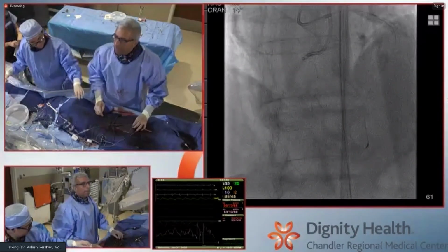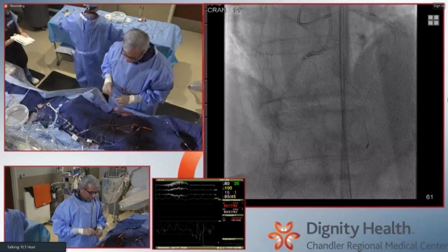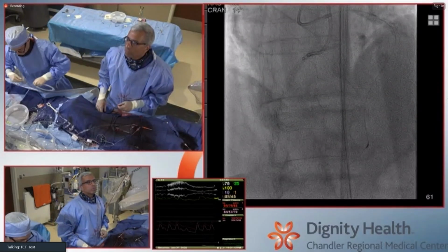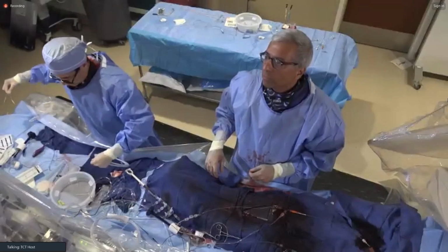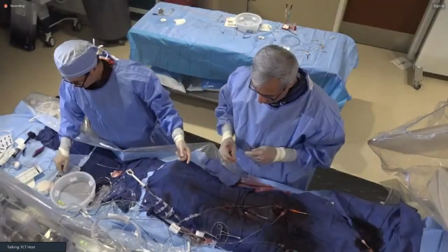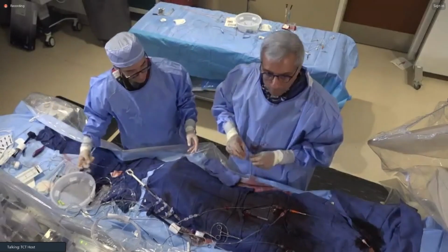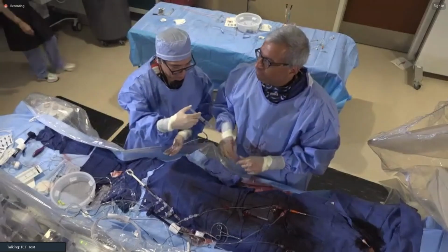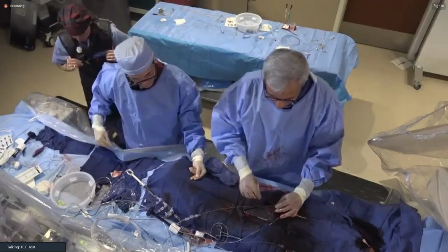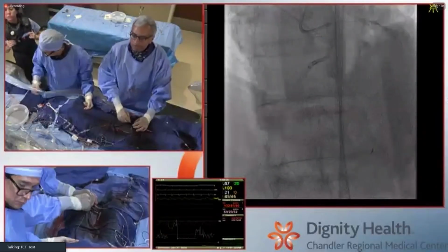Long. Very long. I guess the other thing, Akiko, to your point, is in most of these cases now, we don't have to aggressively size distally because the stent platforms are so hyper-expansible now, right? You can realistically take almost any modern 3.0 stent to nearly 4.0, recognizing that those are third generation, fourth generation DES where the struts are thinner. And so there is that stent recoil issue.